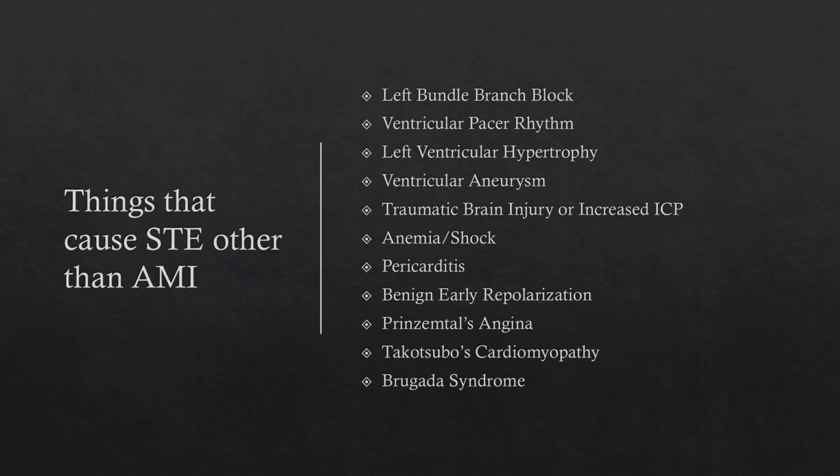So the other thing I'd like to talk about today is some things that can have ST elevation that end up not being an MI. If you've worked any period of time in the ED or in pre-hospital work, you've probably had a patient presenting with chest pain, done an ECG, saw some ST elevation that you thought was a STEMI, then activated, did the whole shebang, and then the patient ends up not being any STEMI. The PCI was either negative, or the PCI facility calls you and tells you you're wrong, it's not that.